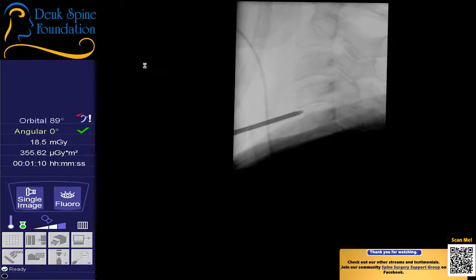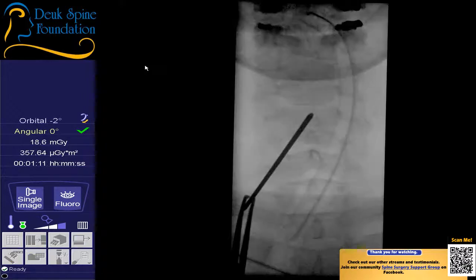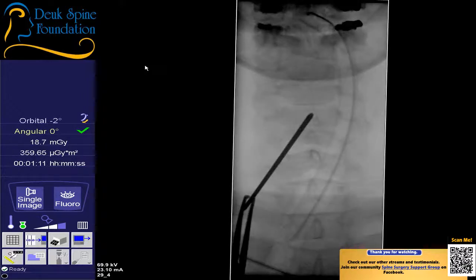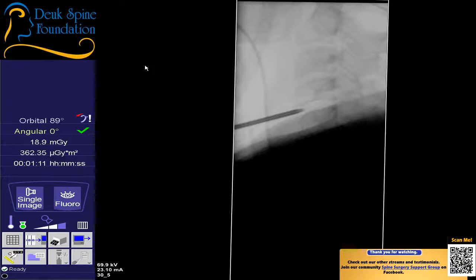Shot. Through the ALL. Now I'll verify one more time on AP that it hasn't moved out of position. It's very important you don't move out of position. There's a lot of very, very delicate soft tissue structures, and steel is always going to win against things like the carotid artery, the jugular vein, the sympathetic trunk, the esophagus, the trachea, the thyroid. Cut. Perfect.